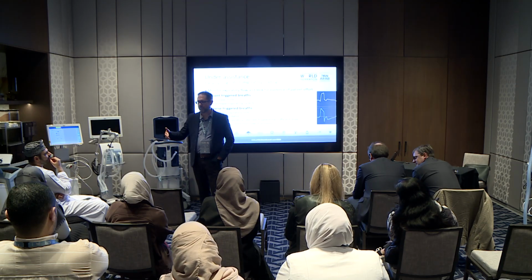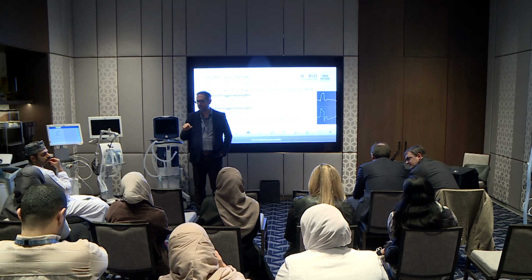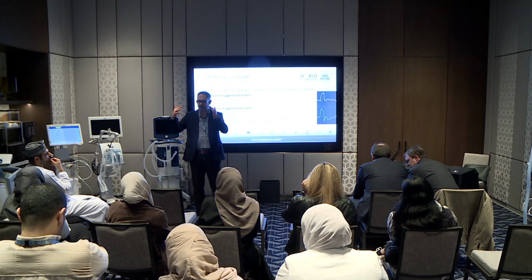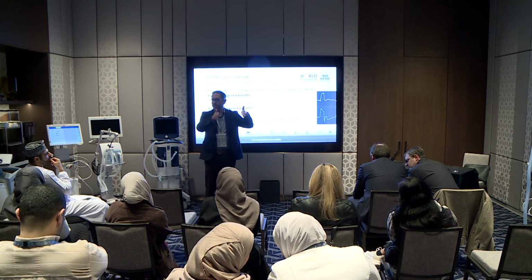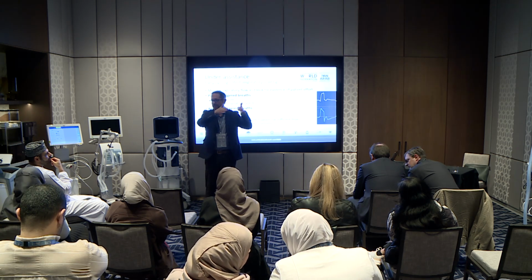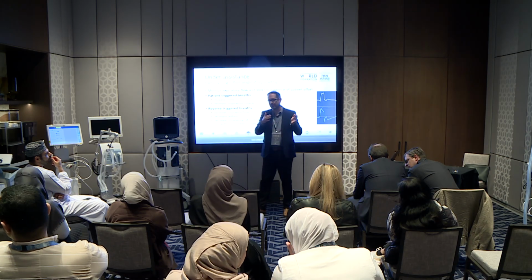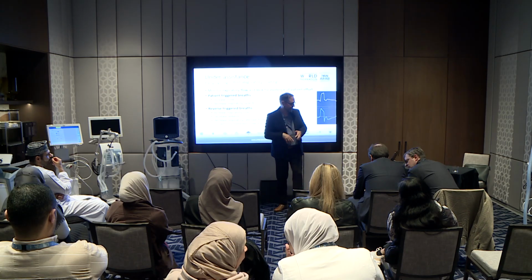If sedation is the issue, they may start to increase. That's why the other suggestion is that if you can turn off sedation, just reduce your rate by 25% while they're reverse triggering, and as the sedation weans, they'll likely start to take over sooner. If you keep the respiratory rate high, they may never start breathing on their own. You might always beat them to it because they just don't have the drive yet. But if you reduce the rate, it may cause that drive as CO2 starts to come up. Yes. So, and then they'll hopefully take over.